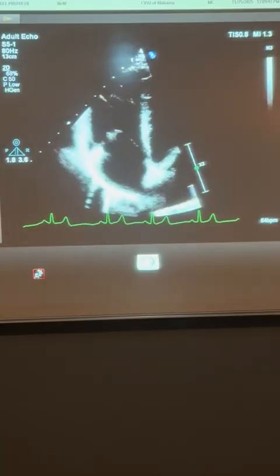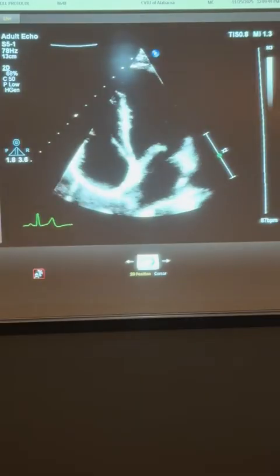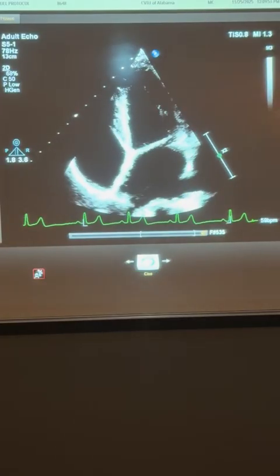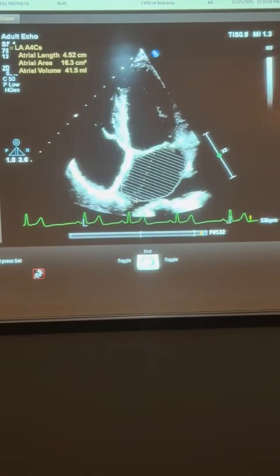I'm going to go back to our left side and optimize our left atrium so that we can get a volume. When getting this left atrial volume, you want to ensure that the atria is as wide as it's going to be, that no more blood is going in or coming out. Make sure we don't dip into the pulmonary veins, and always start and end at the annulus.